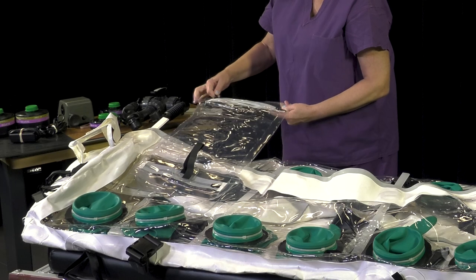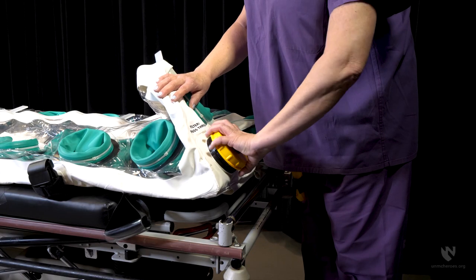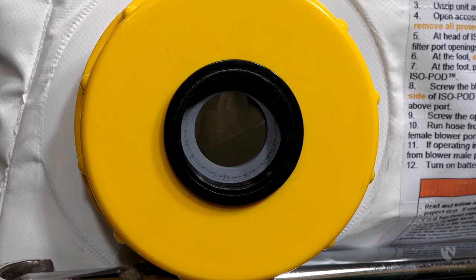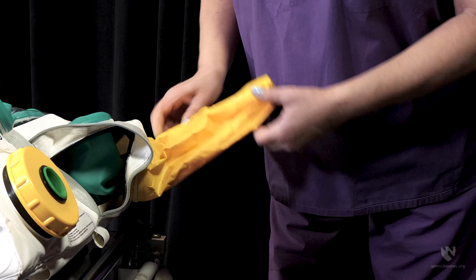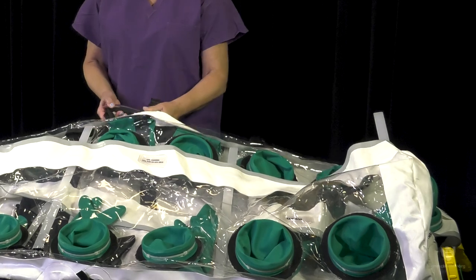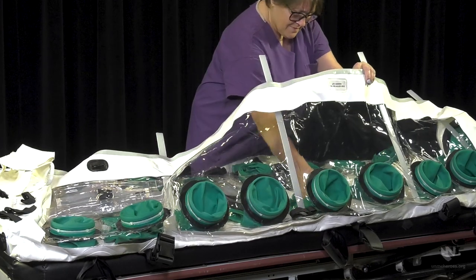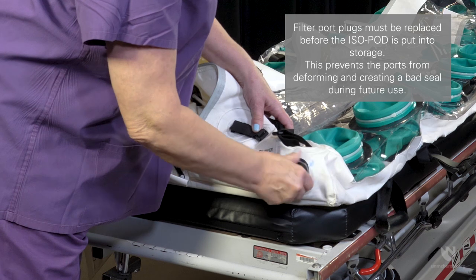Ensure the zippers on the vertical drop port are functional. Verify that the yellow pass-through cap is intact and installed properly, and ensure the gasket in the yellow pass-through cap is present and intact. Check that the hook and loop straps for the head and foot-end snorkel ports are present and operational. Verify transport straps and buckles are attached and undamaged. Check hand grips are attached and intact. Check interior patient restraint straps are intact and buckles are functioning as designed. Check filter port fittings at the head and foot for damage and ensure a gasket is installed and intact.